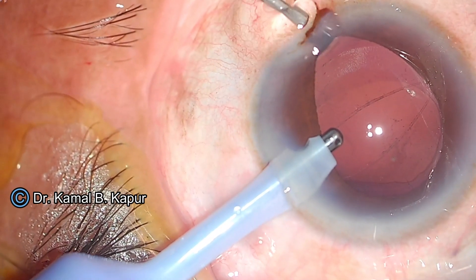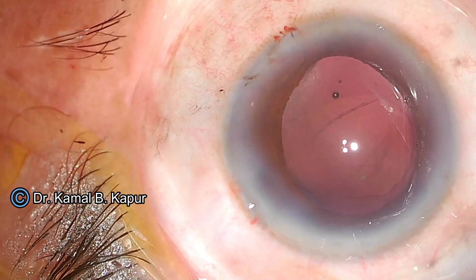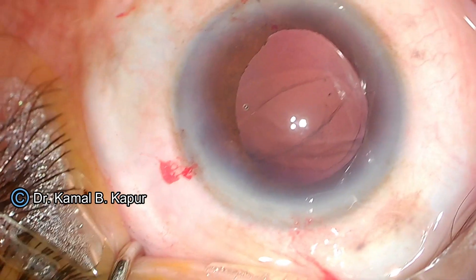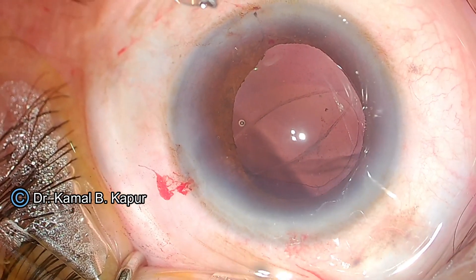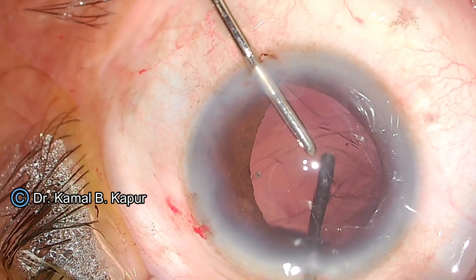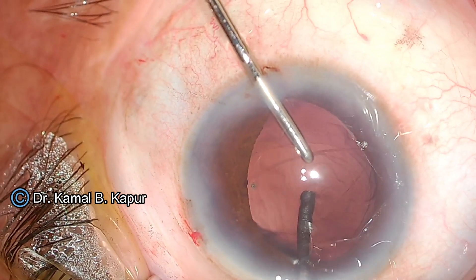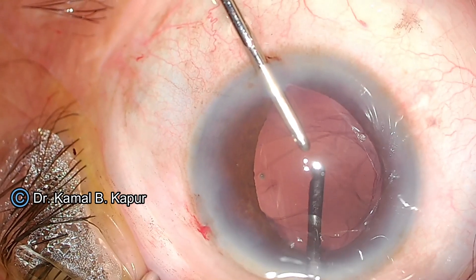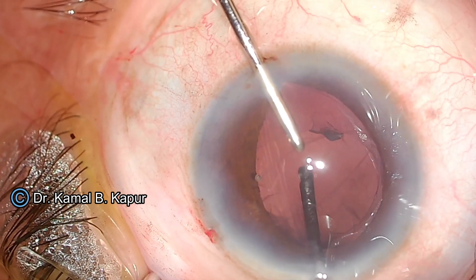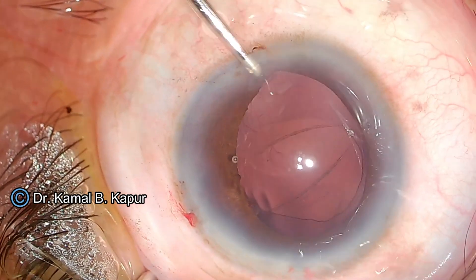Do not withdraw the irrigating instrument — just put a slight amount of viscoelastic, just enough to inflate the chamber, and slowly withdraw. You can see a linear opening, but there is no loss of cortex and no loss of nucleus into the vitreous cavity. I will now do a vitrectomy, breaking the anterior vitreous face. A controlled vitrectomy is performed only in the area of the PC opening, because once I start placing the three-piece IOL, any breach of the anterior vitreous face will cause trouble dialing the IOL into the sulcus and lead to more vitreous loss. You must ensure the fluid turbulence is not excessive, otherwise the tear will extend to the anterior capsule.